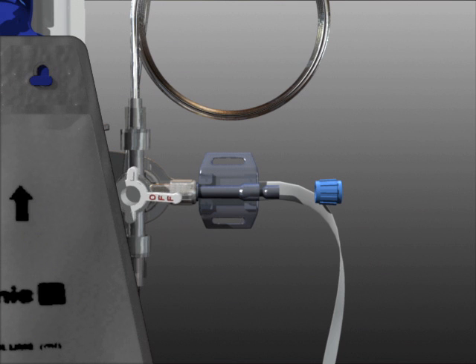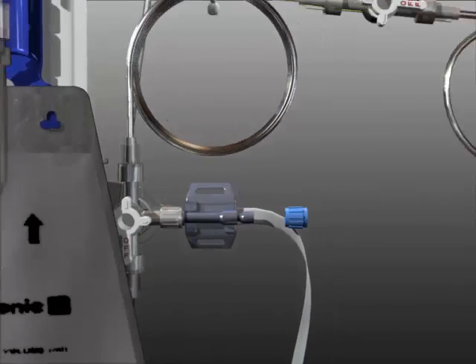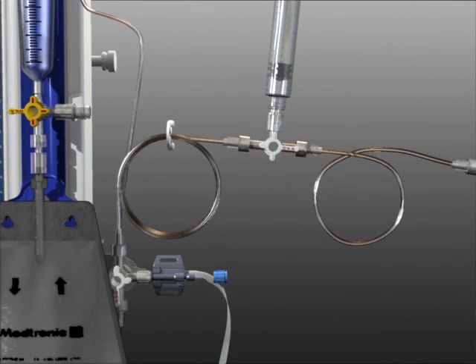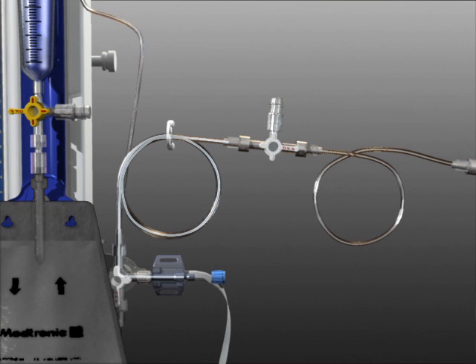Rotate the main system stopcock as shown so fluid flows from the patient line through the transducer, flushing all air bubbles from the transducer. Once complete, retighten the end cap on the transducer.